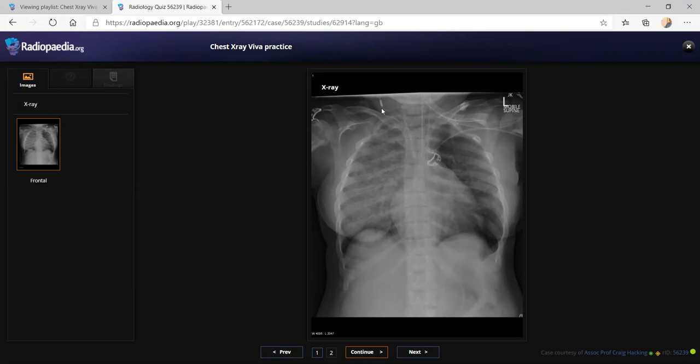Yeah, I was talking about that line actually, the one that we just marked. And the tip, I can't see the tip. You called it correct, and that was not at the ideal position. And there is another line that is going that I did not see, that's coming from the neck and going down below. That is a VP shunt. VP shunt, correct. So at that time you can understand that there is something going on in the head.